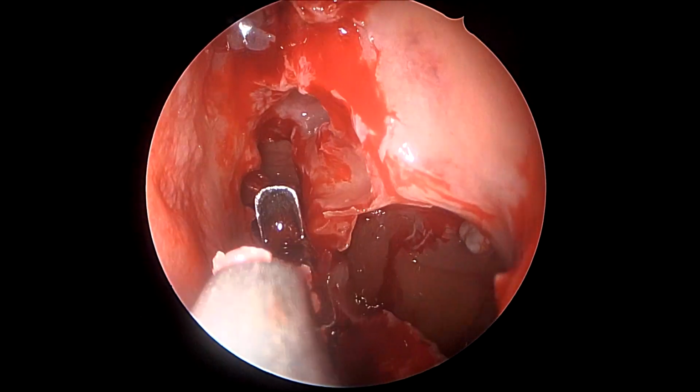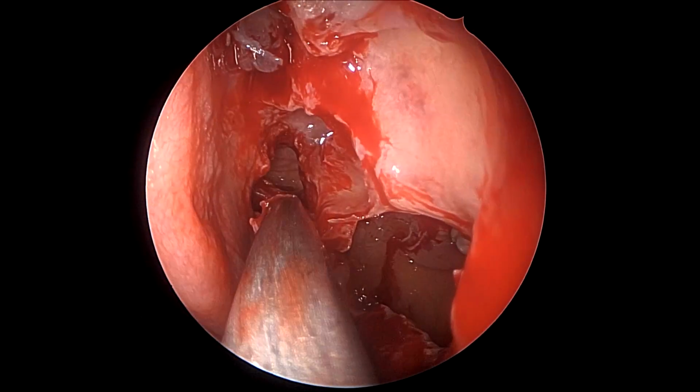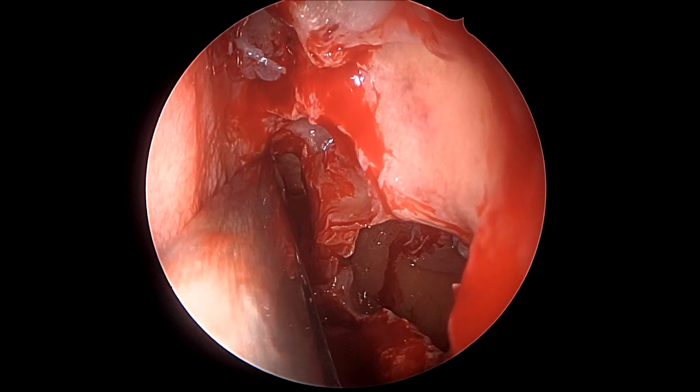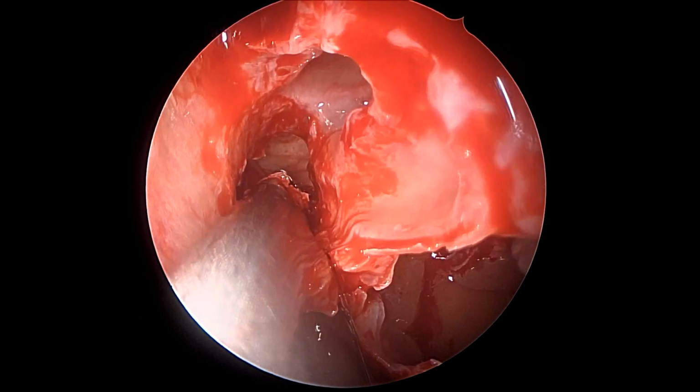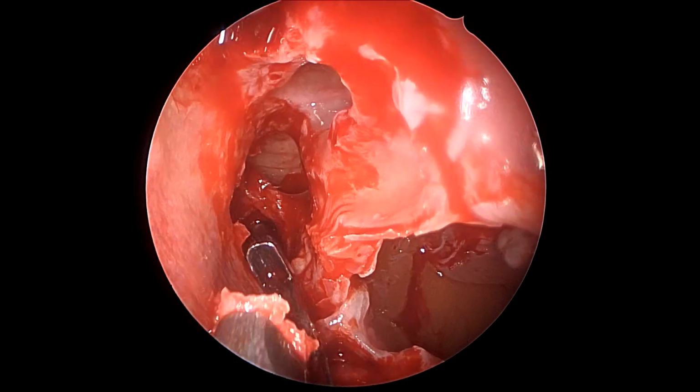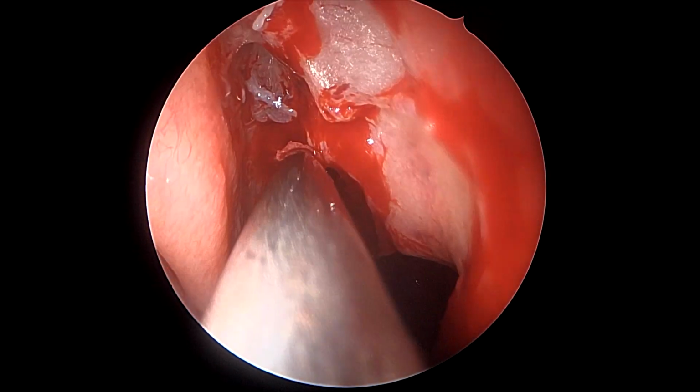Now, as we open more and more ethmoids, we keep going anteriorly, and as the skull base slopes superiorly from posterior to anterior, we can progressively remove more bone using a punch while palpating the level of the skull base.